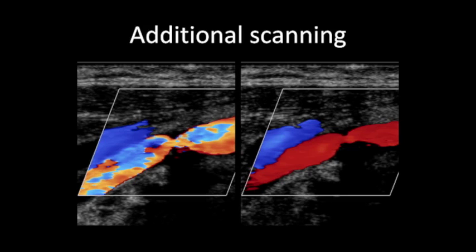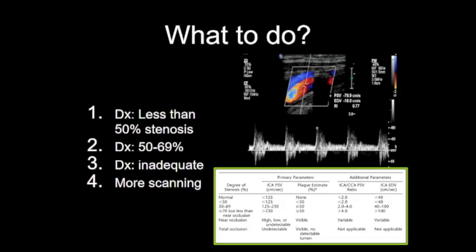There's one other thing that I don't show here, and I routinely tell my technologists to angle the steering box downward instead of upward, because they're always thinking about putting the box up towards where they're going. But you want to get underneath this plaque. The other way to get under the plaque is by angling downward, because the shadow is going to cast itself down towards the feet, and you get a little bit more inside of the plaque. That's another trick that I tell them to do.